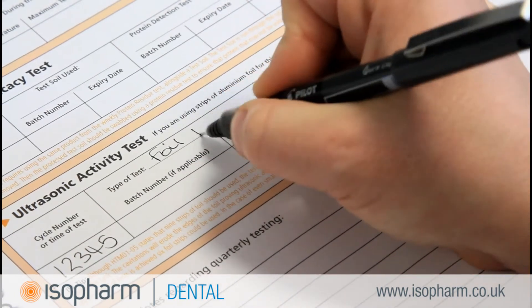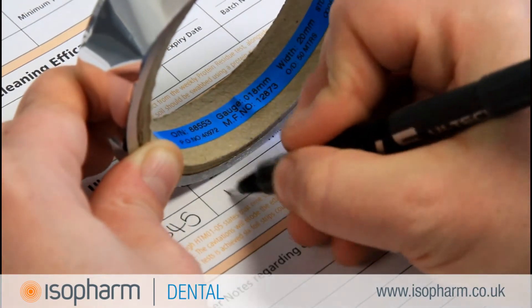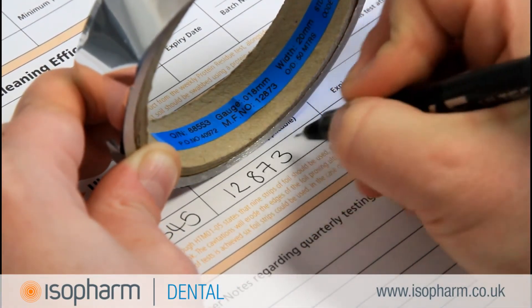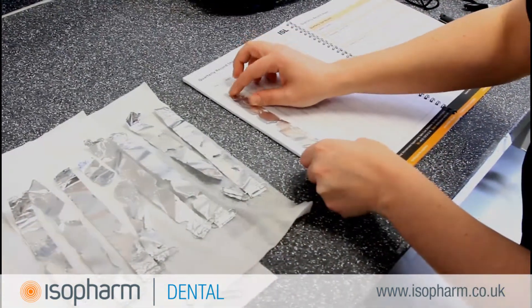Isofarm Logbooks provide the necessary tables for recording the use of foil strips. Make sure that you watch the Isofarm movie on how to perform an ultrasonic activity test, which can be found in the Testing and Validation section of the Isofarm website.